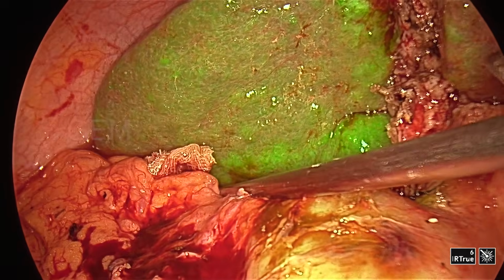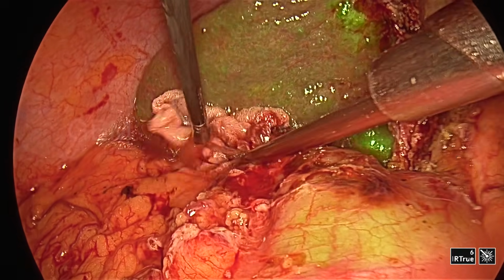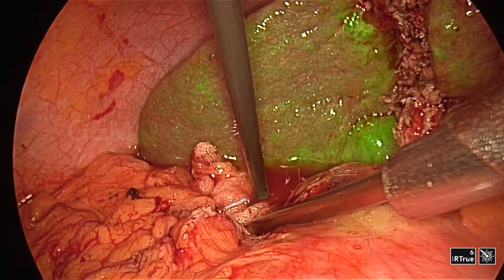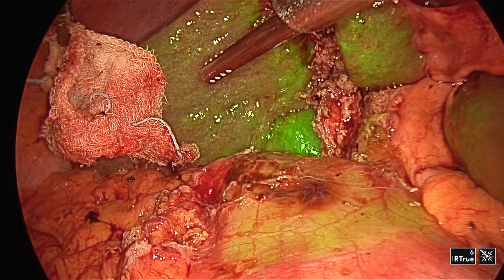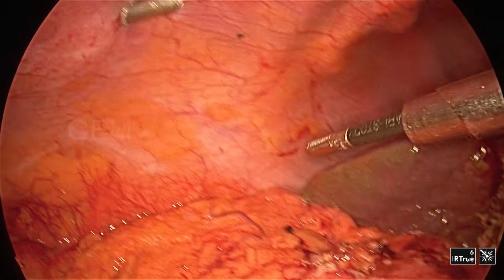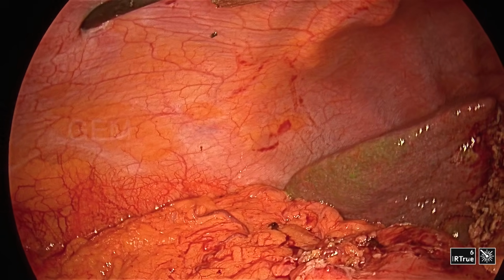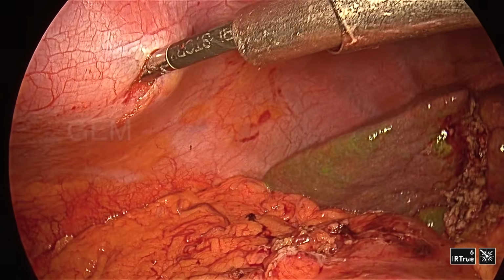So almost 7 centimeter from the infundibulocystic junction, 7 to 8 centimeter distance it is coming down, and then it is inserting into the CBD. So with the ICG help, I could trace out the cystic duct, and then I did the surgery, and I keep a drain, a little large drain, always when suturing the CBD or cystic duct and infundibulum. Keep a large drain and keep it for 4-5 days.